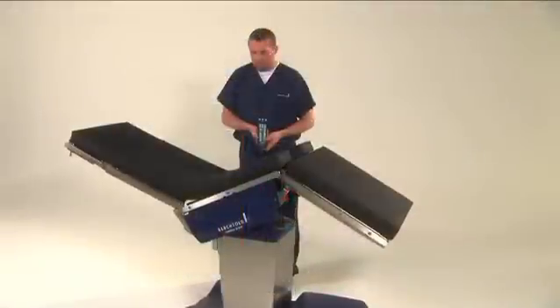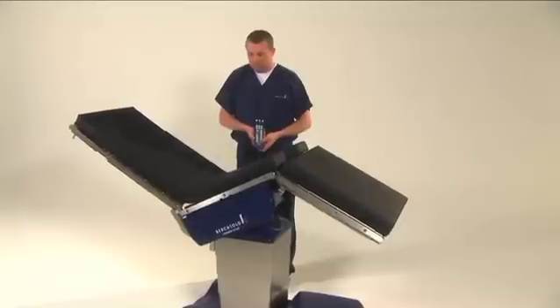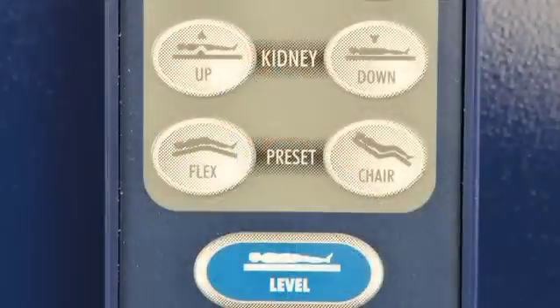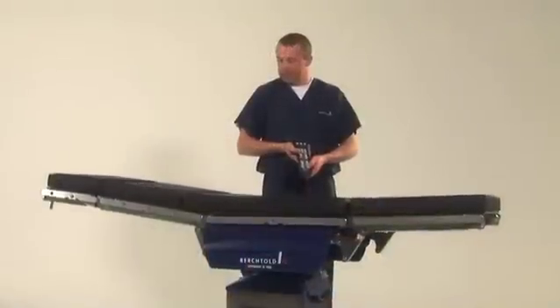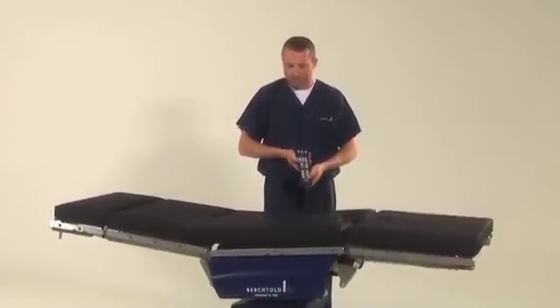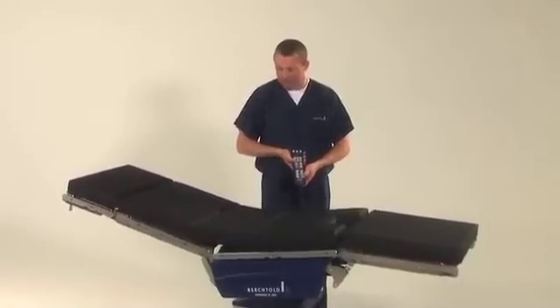Beach chair positioning is common in breast augmentations, mastoplexies, mastectomies, and shoulder applications. To use this position, press and hold the chair key. The table's back section will automatically raise by 10 degrees, and the leg section drops. The table will repeat the movements until the desired articulation has been achieved.